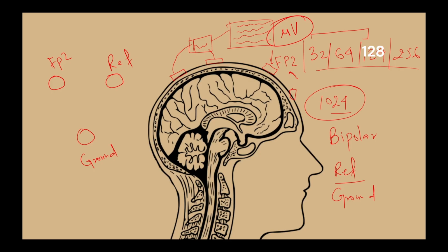So how do we set up all these things? Suppose we measure voltage: the voltage at ground is V0. At this channel, let's call it VC, and this is V reference.